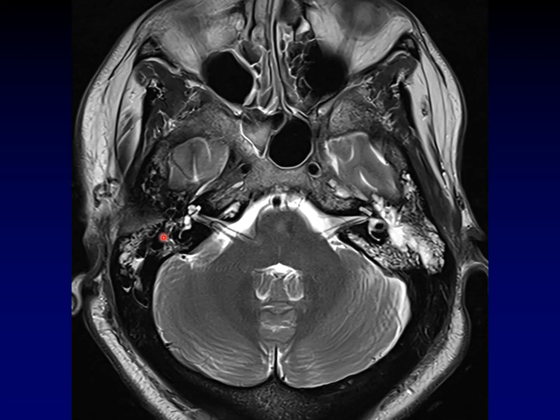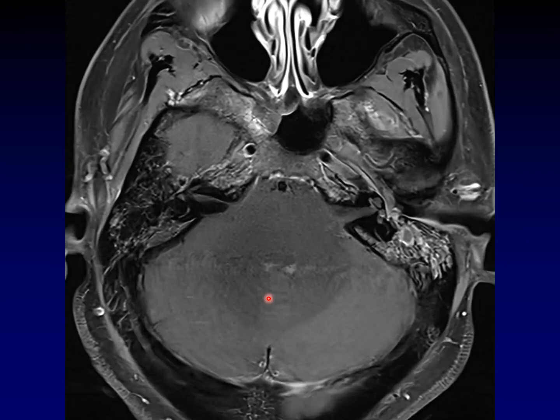Let's take a look at the post-contrast imaging in this same patient. Sure enough, there's enhancement around the mucosa of all of these air cells — this is indeed mastoiditis. Whereas on this side, we don't have that same enhancement. This is just a mastoid effusion.